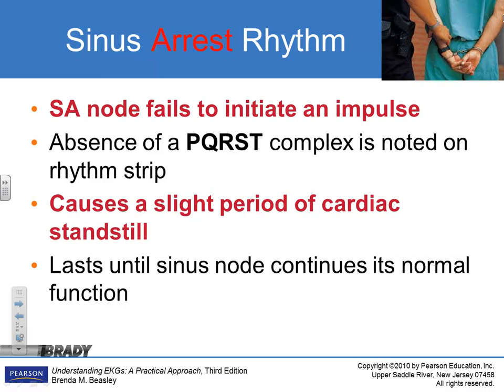Usually, what you'll notice with sinus arrest, if you don't have an impulse coming from the sinus node, what won't happen in the ventricles? Well, there won't be a P wave. There won't be any QRS either. So you just have your normal complexes, and then you have this dead zone, and then it picks right up. So it causes a short period of sinus with cardiac standstill where there's no pulse.